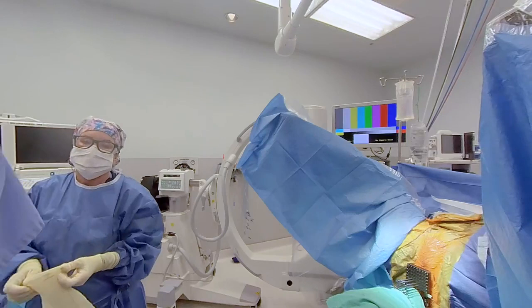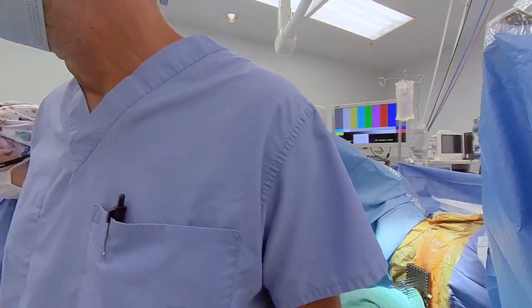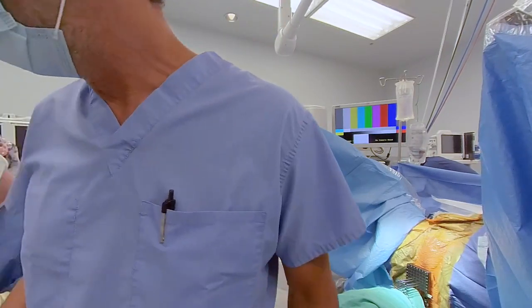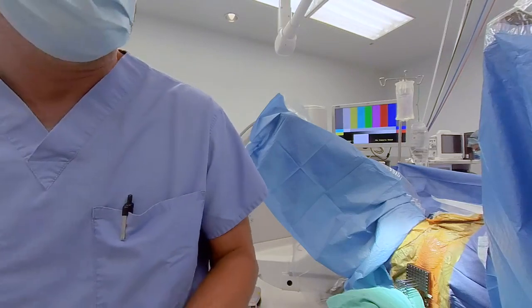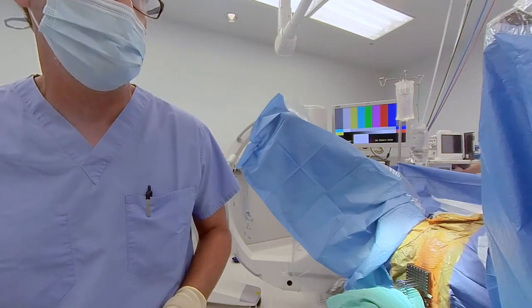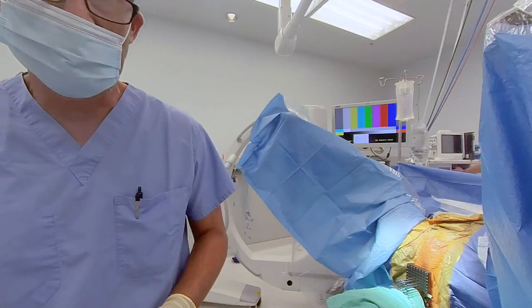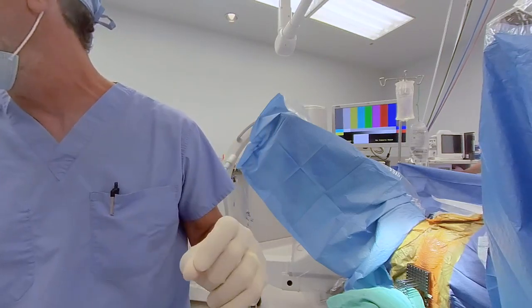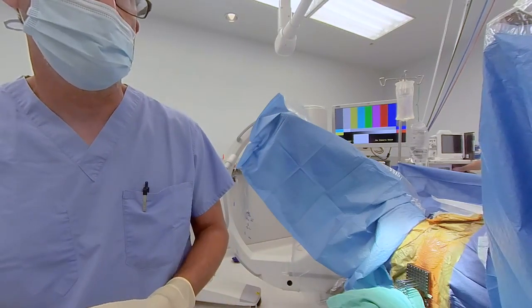Great. So the iteration and the manual manipulation takes less than 5 minutes generally. That's great. While you're getting prepped, can you just tell us a little bit more about your thoughts on bladder neck dosing and how it's related to bladder toxicity? Yeah, so in fact, Memorial Sloan Kettering has published data demonstrating that if you can limit the bladder neck dose below the prescribed dose, there's a significantly reduced risk of both acute and sustained urinary toxicity. So it's good to know where the bladder neck is. Some programs allow you to draw the urethra at the bladder neck as a separate structure. We just look at the isodose curves around the bladder neck without drawing an additional urethral structure, to get a sense of where the urethral dose is and try to limit that.